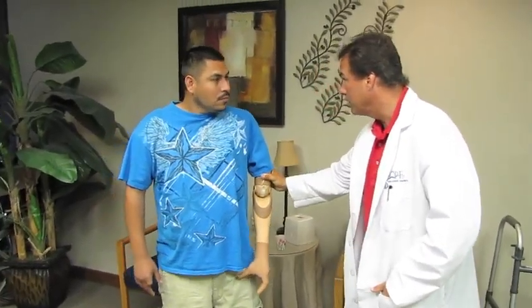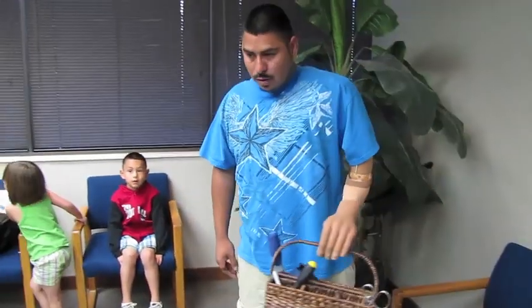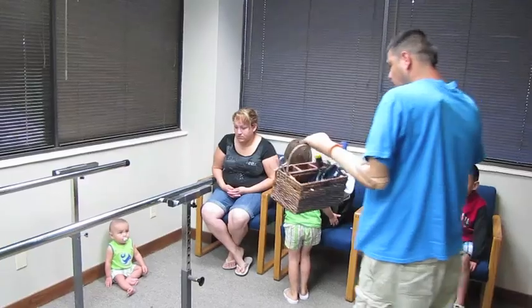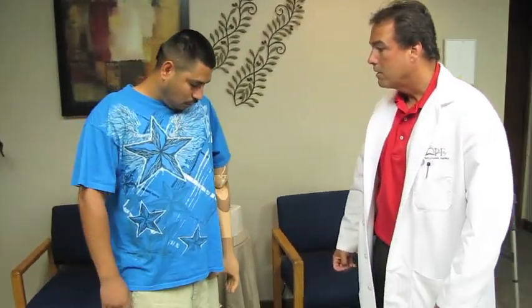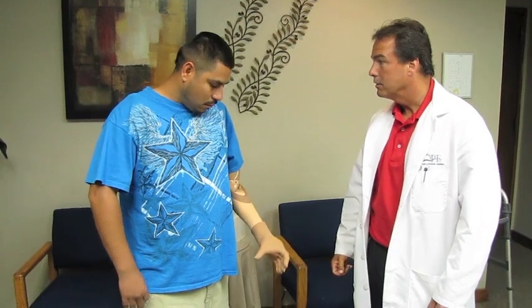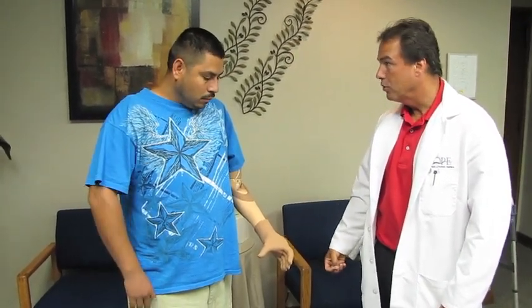As far as how much weight you can lift, when the arm is straight, you can lift quite a bit. It depends on how much it's going to support this way. The elbow bending — you'll hear the motor tell you it's not going to lift anymore. The basket that you were lifting, you can tell that's just about as much as you can lift. You can hear that it's not wanting to do anymore.